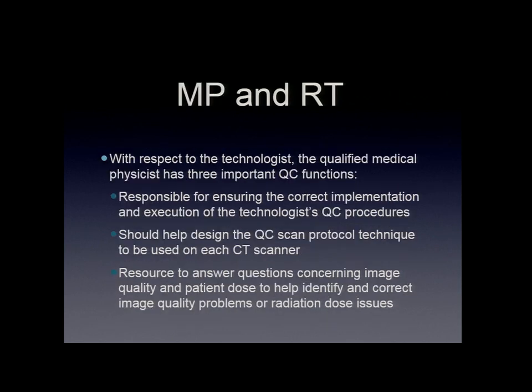Of course, the medical physicist and the RT also have to have an important, ongoing relationship. The RT is there day to day in the field, using the scanner every day. They know what's going on, how it operates, its little nuances, and what they have to do. And so they can document that kind of stuff as part of the QC program.